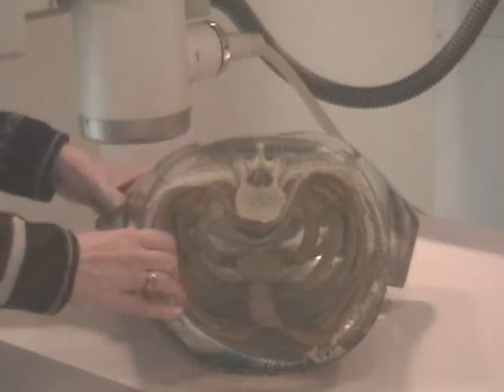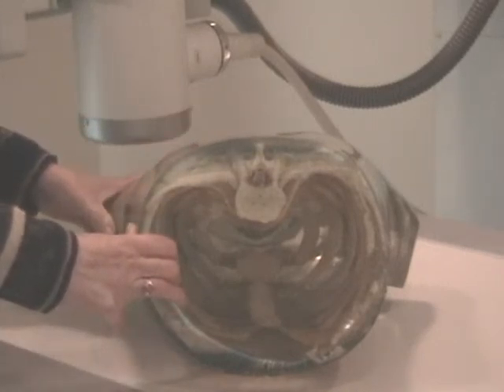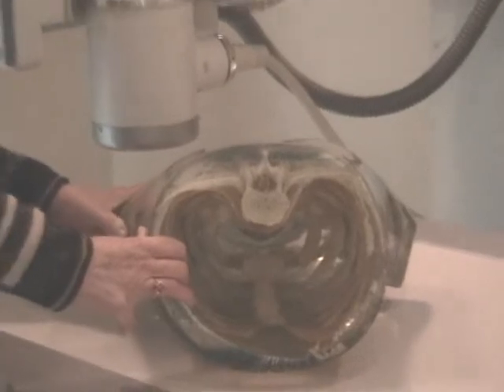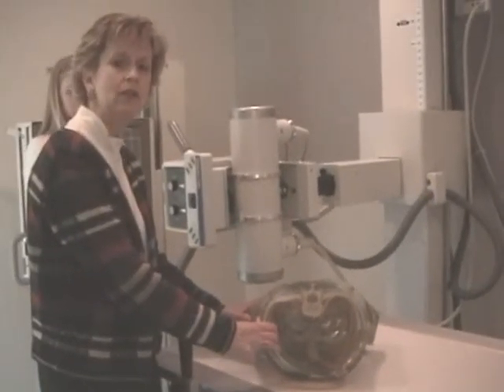But what we want to focus on with the skeleton here is the obliquity. We've taught you in previous lessons that when a patient reverses, things reverse. Okay? We were shooting APs. We were shooting with the patient's back next to the film.